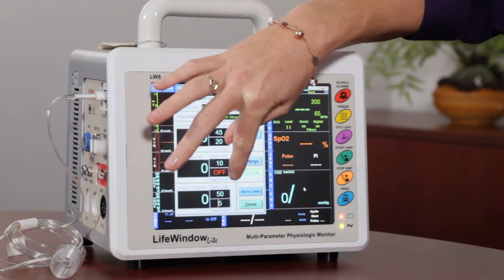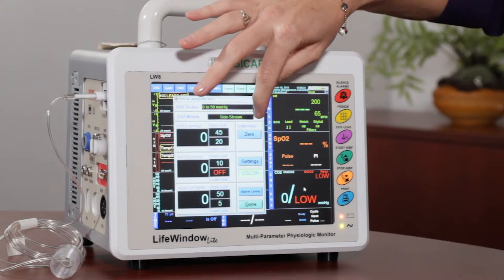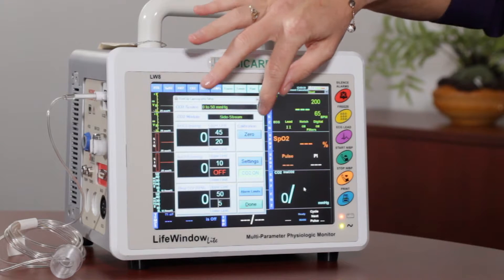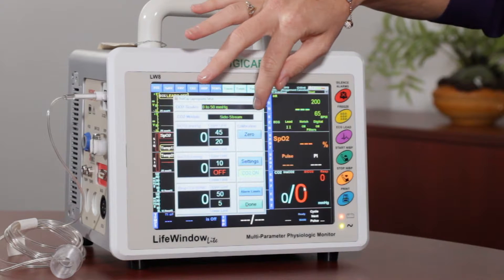Next to those numbers is the high and low limits. The only portion that you really need to use on this setup is the zero calibration. You do need to zero calibrate your CO2 if you have side stream and or mainstream CO2. Zero calibrating is very important for the accuracy of the CO2 readings.